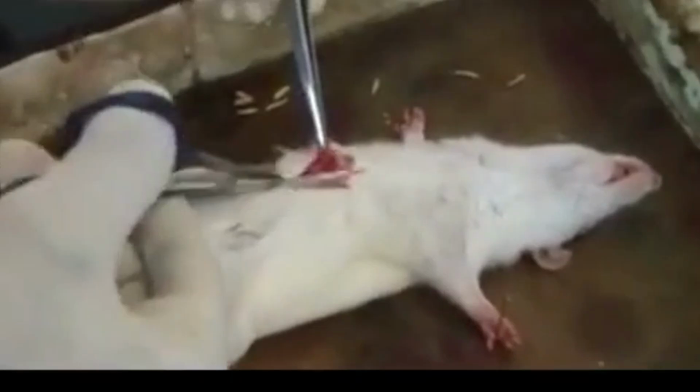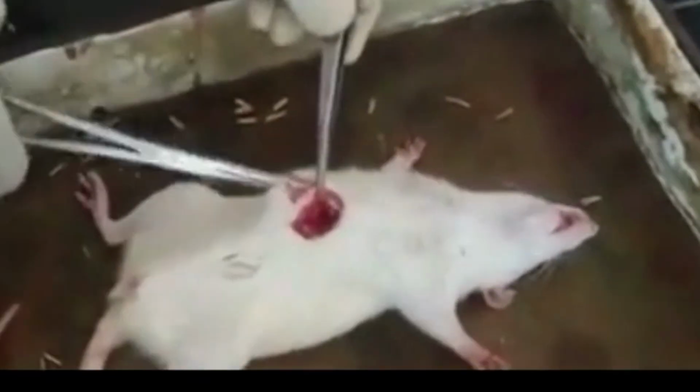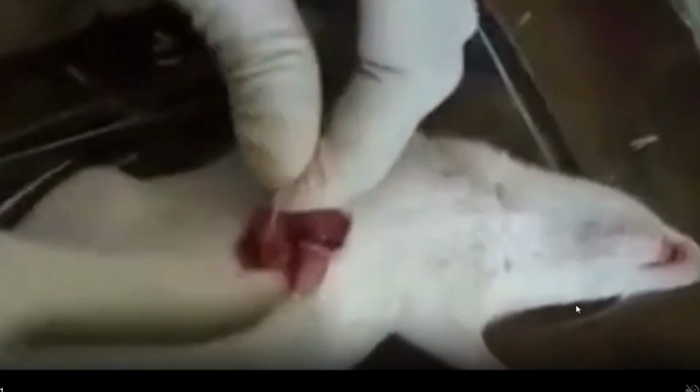We will cut the peritoneal cavity and open it, and we will pull out the stomach and ligate the lower end, meaning the pyloric end of the stomach. So now you can see we are ligating the lower end of the stomach.